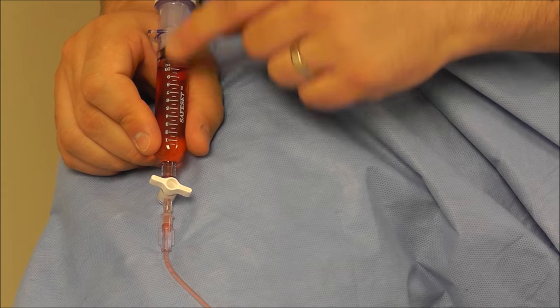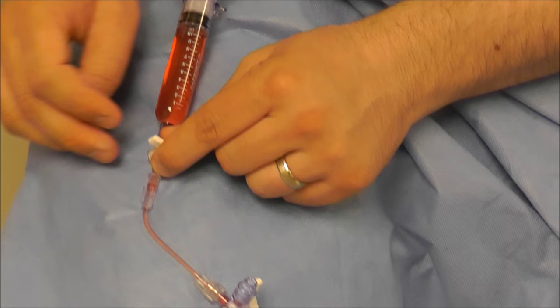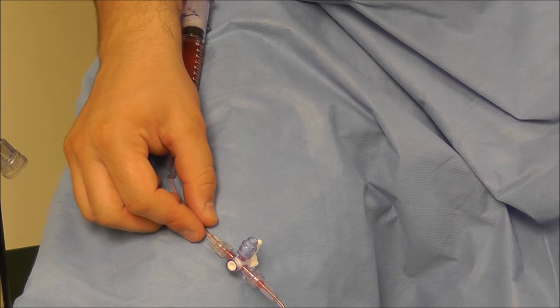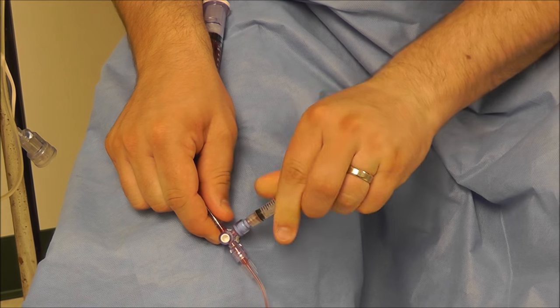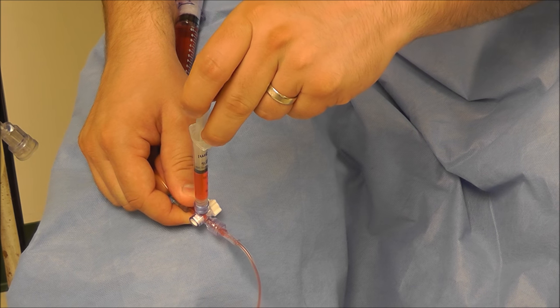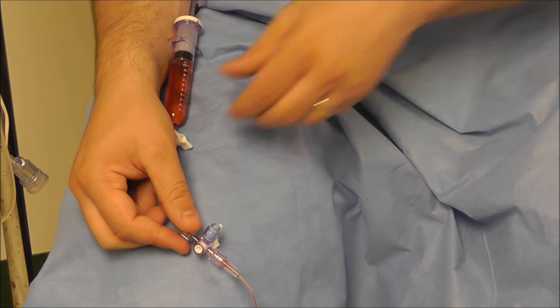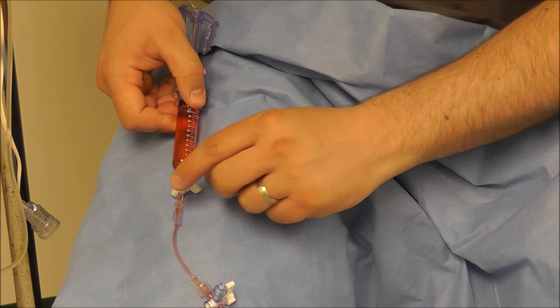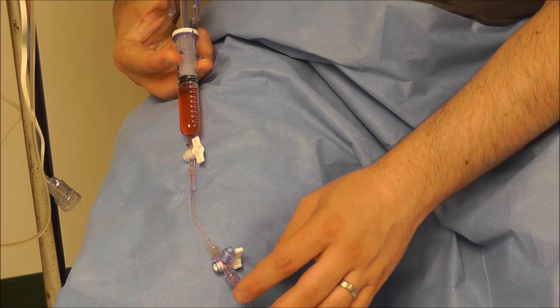Once that's all drawn in, we want to make sure we turn our stopcock anti-parallel. We then take our 3cc blood syringe, hook it up to the stopcock, and we withdraw our undiluted sample of blood. We send this off. Next step is we turn this stopcock back parallel, and we go ahead and push on the plunger and flush it.